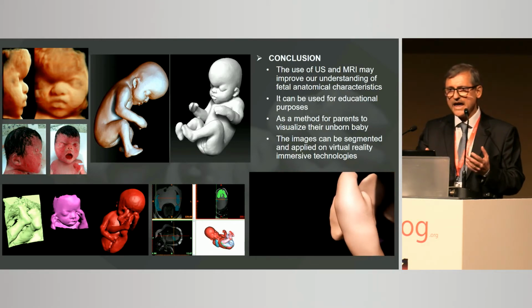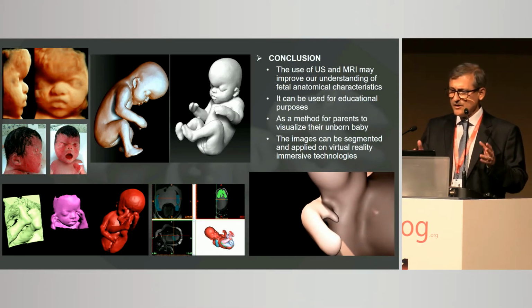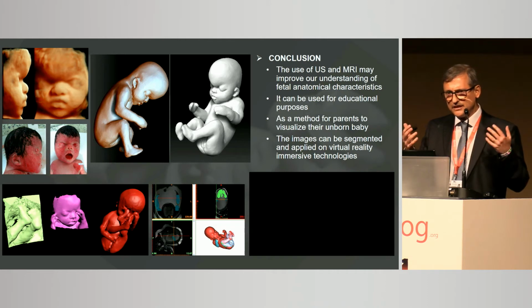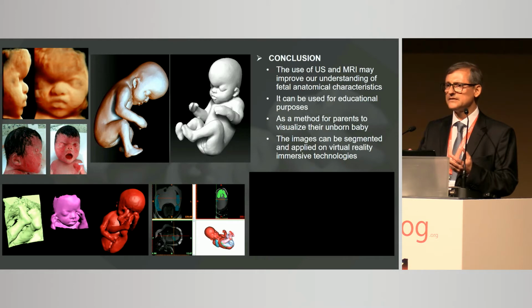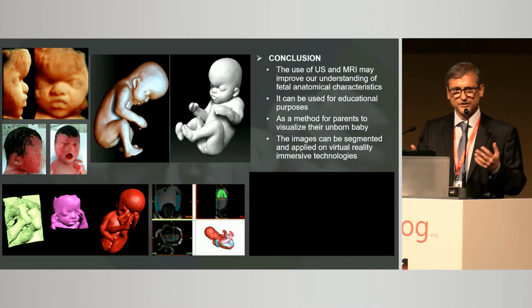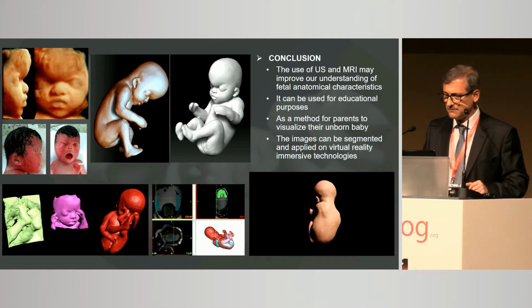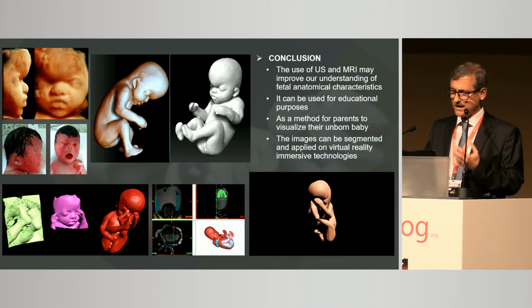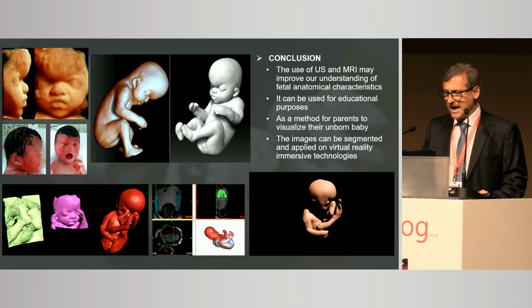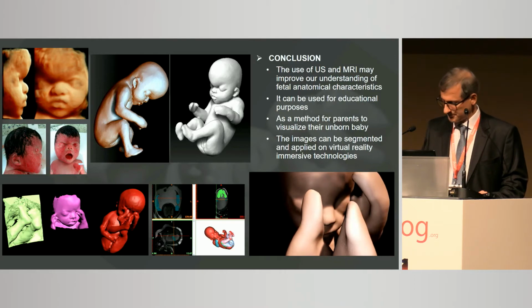So we prepare case for students to study. It's the same, ultrasound and MRI, they give very nice images and volumes. We can use all of this and work more on this to prepare different views for students and multidisciplinary team. It can be used for education purpose, better visualization for parents, and images can be segmented and applied on virtual reality immersive technologies. Thank you very much.